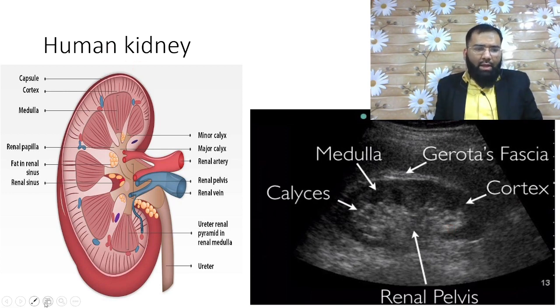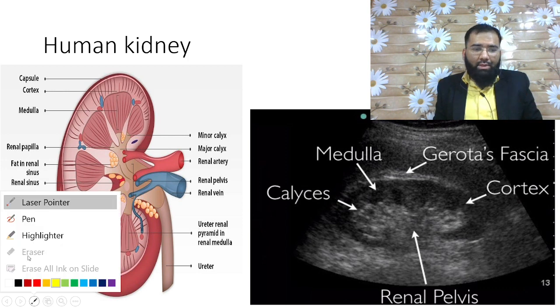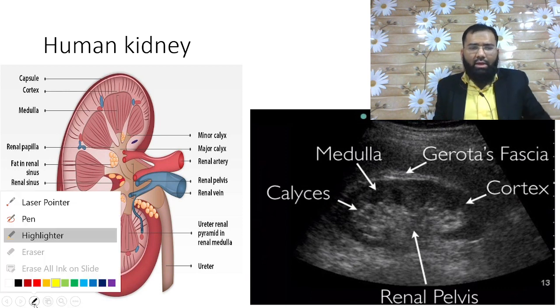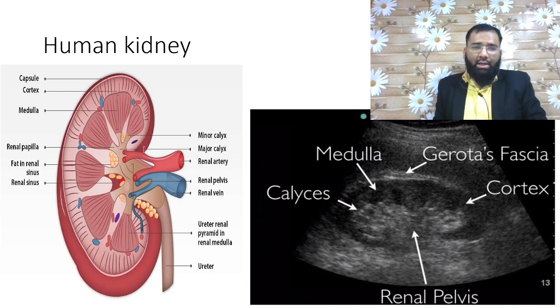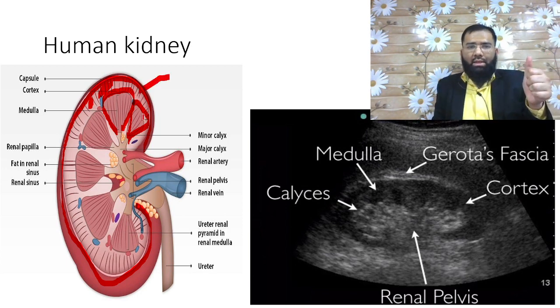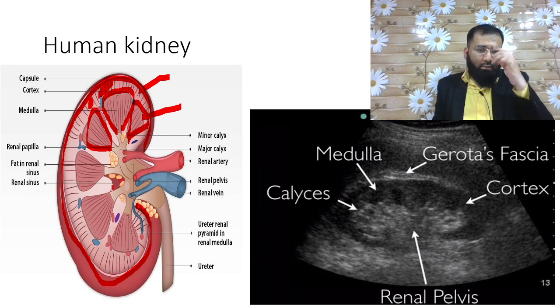So now we'll discuss a bit of the anatomy portion. So how the kidney appears. For this, let us start. So basically, the human kidney, now you're aware that it is located in the lumbar quadrant. It is retroperitoneal. And the kidney is surrounded outside by a capsule. This capsule is a tough renal capsule. Now you see that these structures which you are able to see, these are all the renal medulla. So they are called medullary pyramids. And this outer portion, this outer section, is called the cortex. So outside lies the renal cortex, inside lies the renal medulla. Each of these is a renal pyramid. This we know, all of this we are aware of.